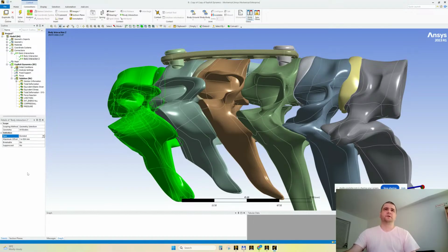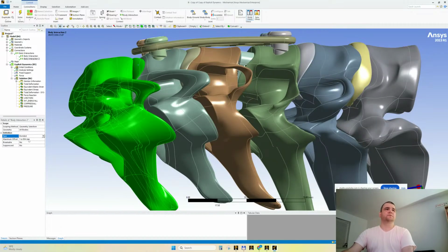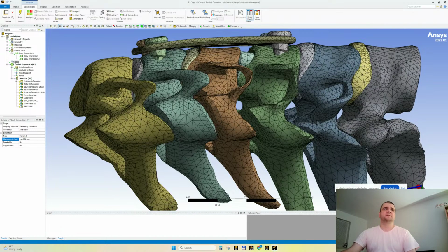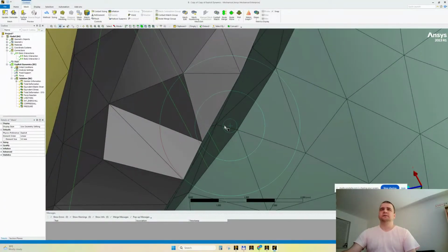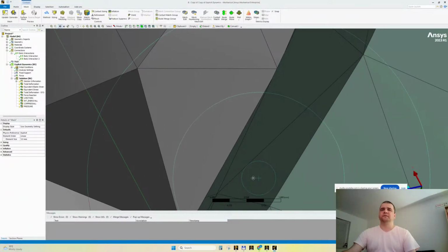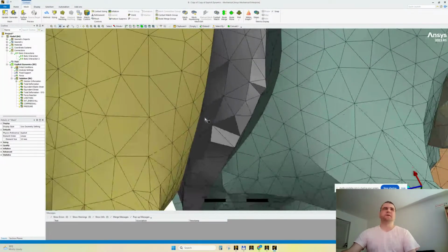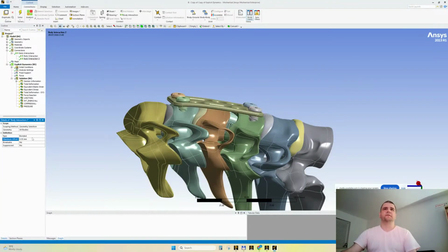What I would like also to have, because there are some gaps in the touching between the parts, there are some gaps. What I would like to do is to make like a pinball radius here. So let's make this 0.51. Let's see if there are some. I would like to see this a small dimension. For example, here 0.25. Let's make it 0.5. Yes, or something in between, 0.35.